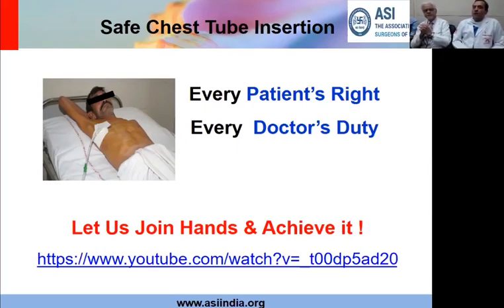Yeah. So as a matter of routine, there is no need for putting suction in every patient. Whether the patient has pneumothorax, pleural effusion or hemopneumothorax, you put a chest tube. Ensure that the bottle is put properly. Ensure that there is no kinking of the chest tube. Sometimes your stitch may be tight and there could be some narrowing here.